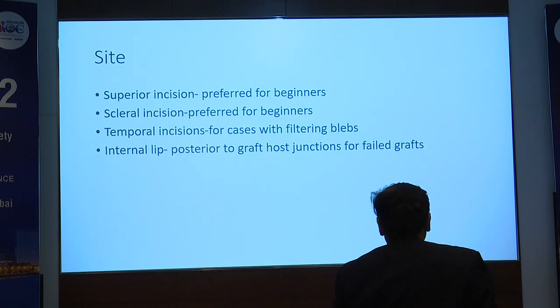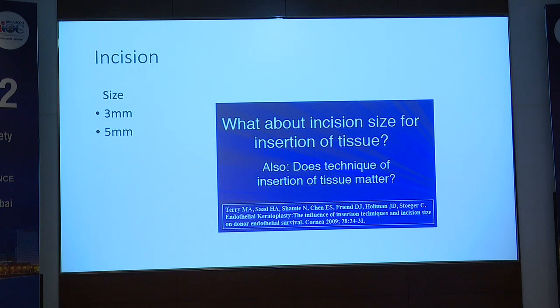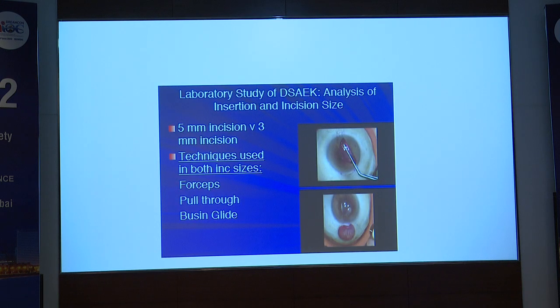Remember, the internal lip, which is posterior to the graft-host junction, can be used for failed graft. Again, the size of the incision can either be 3 millimeters or 5 millimeters. It's preferred to use a 5 millimeter when you're a beginner so that you compress the tissue less and in turn have less endothelial cell loss while you're doing the insertion.